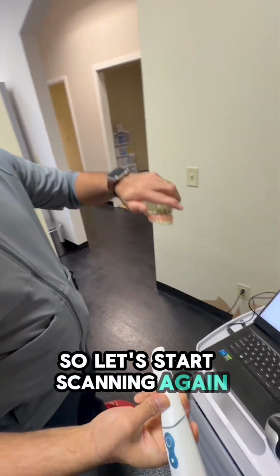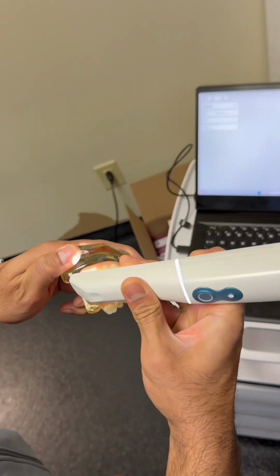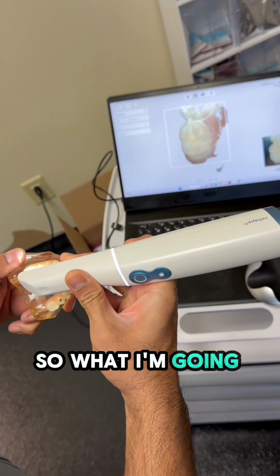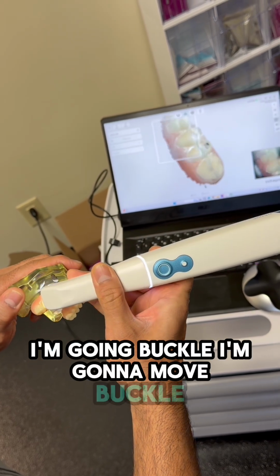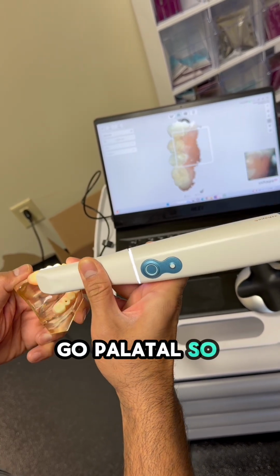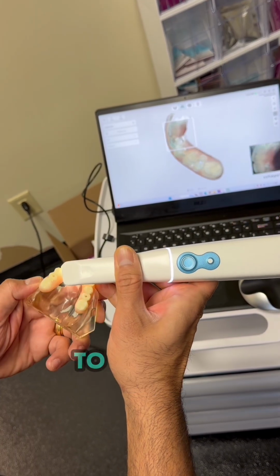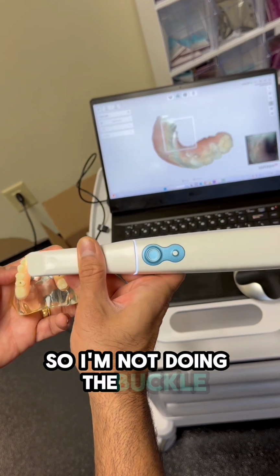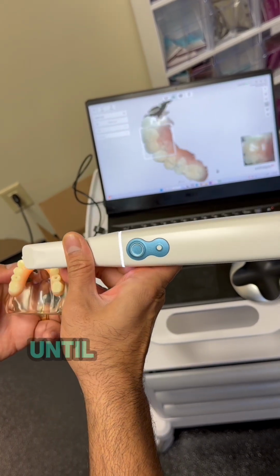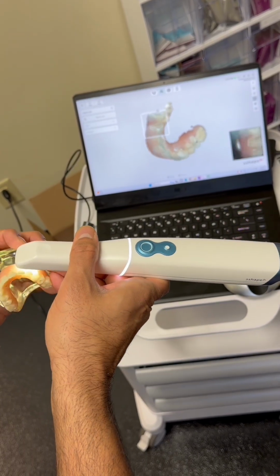So let's start scanning again. This is a maxilla. I'm going to bring my scanner. So what I'm doing is palatal, and immediately I'm going back and going buccal. I'm going to move buccal, go palatal. So remember your concepts: the camera now has every image to stitch to a previous image. So I'm not doing the buccal-lingual rotation until I move on to my next frame and the previous scan.